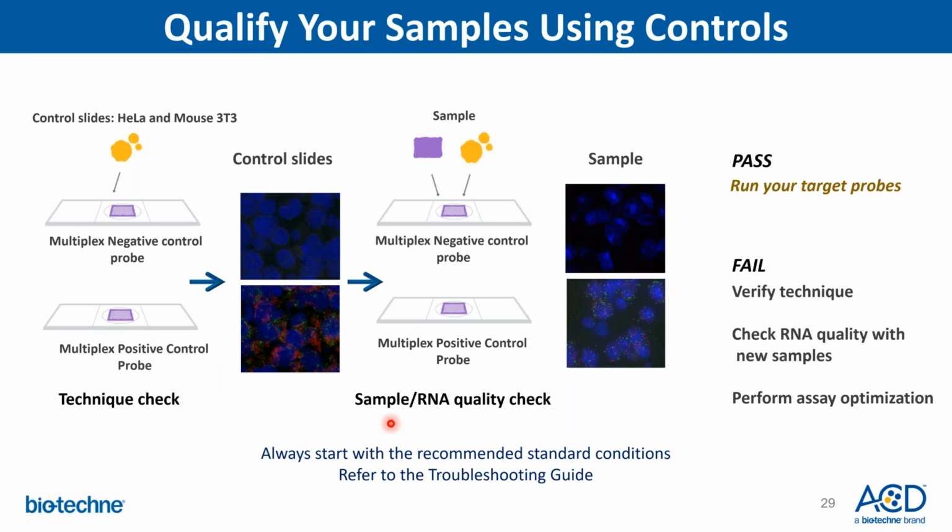Once you do the technique check, then the next thing you would do is the sample RNA quality check using the same multiplex negative and positive control probes. And once that passes, you can go on to run your target probes. However, if that fails, we recommend that you go back and verify your technique. If the RNA quality in your samples is undermined, then we recommend to check RNA quality with newer samples, and if needed, contact technical support for advice on how you can perform assay optimization for your sample type.